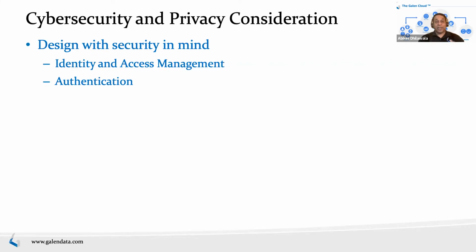You always want to make sure that cybersecurity prevention isn't affecting your risk profile, and that you're not putting a patient or a provider in any kind of harm because you're expecting them to type in a long password in an emergency. Right? It's not going to happen. So you have to always keep that balance in the risk processes, and safety and cybersecurity have a lot of intersection. You want to keep that in mind. But for some sort of remote function, if there is one, you want authentication.